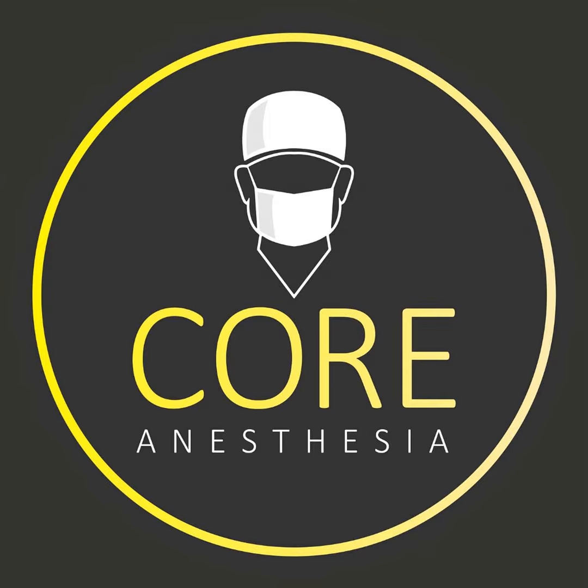Now, if they're a lot closer to delivery, though, I usually tell patients this works by gravity. So if you're starting to have pain further down, we can sit you up and try to give you more volume, let that medication run down. Or if they're having more pain on the left or right side, we can tilt them on their left or right side and give that time for the medication to run down to that side of their body.